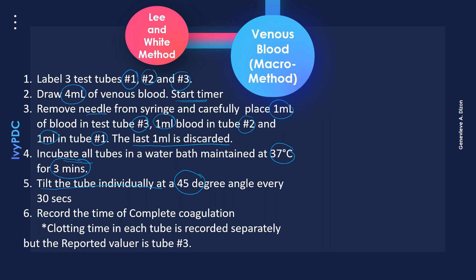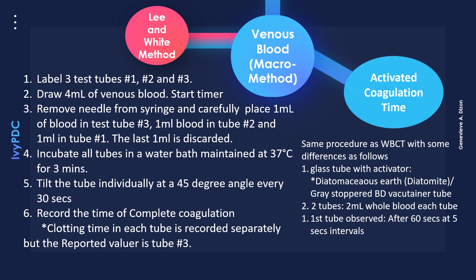Incubate all tubes at 37 degrees Celsius for three minutes. After three minutes, tilt the tubes individually at a 45-degree angle every 30 seconds, watching for complete coagulation. Complete coagulation is described as when the tube can be inverted without its contents spilling. When complete coagulation is achieved, record the clotting time. The clotting times of all three tubes should be recorded separately, but only tube number three's value is reported.